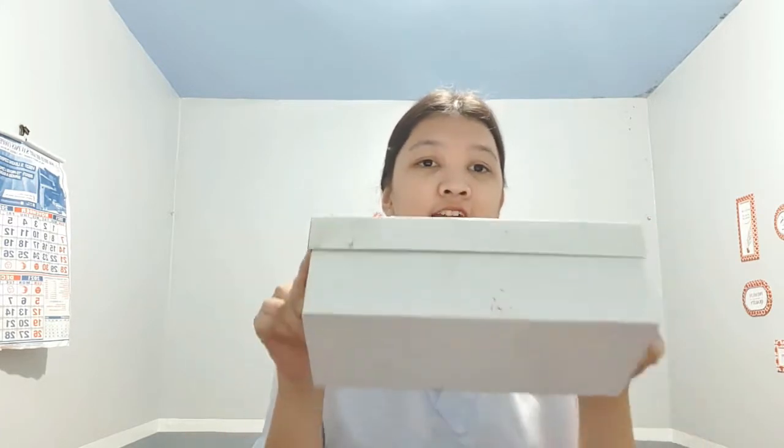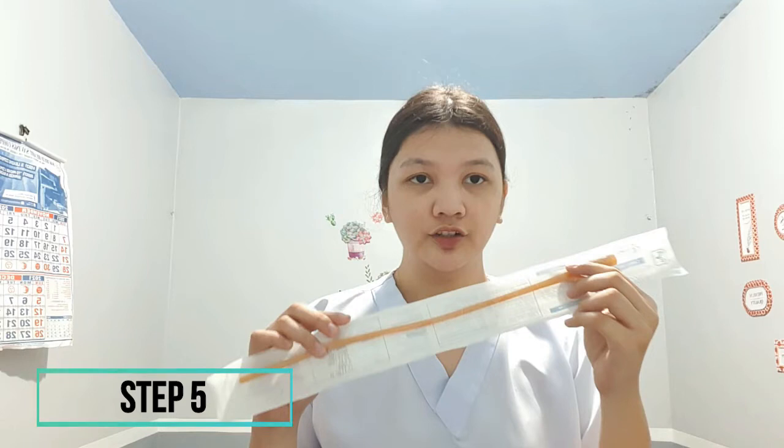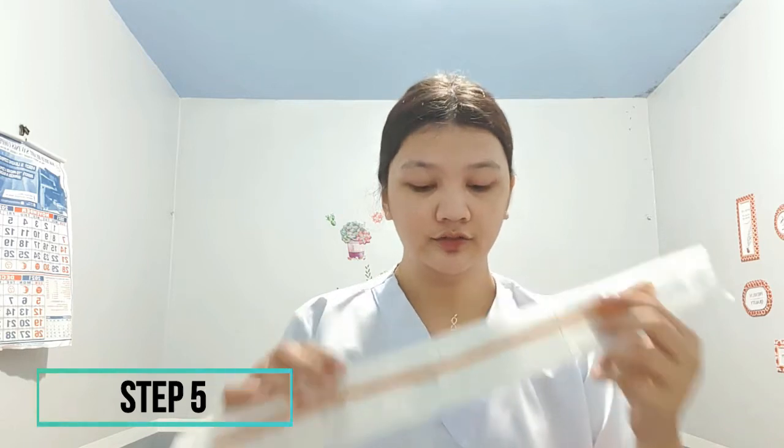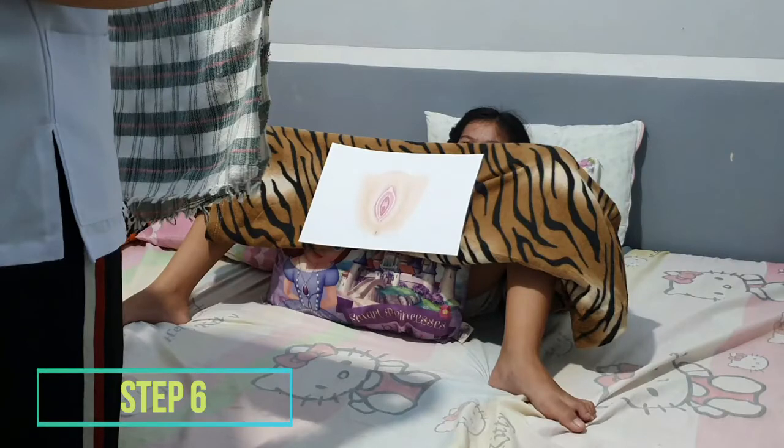Next, gather all the necessary equipment that we will be using for the procedure. I have here my sterile gloves, my drape, a waterproof pad, and a catheterization kit with a foley catheter. Check for size and type of catheter and use the smallest size of catheter if possible. Urinary bag, cotton balls with cleansing solution, forceps, lubricant, a securement device, and a syringe that is pre-filled with sterile water.